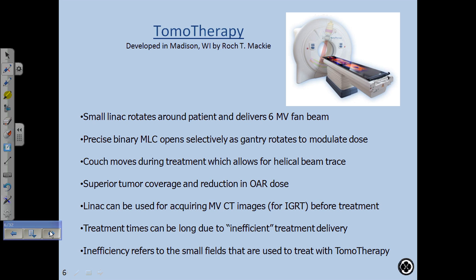So the tomotherapy machine, Don, you've seen one. You guys seen the tomotherapy machine? You two guys? Okay. Tomotherapy machine, Lutheran General Hospital, Rush has one. They're pretty much all over the place now. Good Sam has one. There's one in Joliet, at least one in Joliet. Zion has one. Here. They're in a lot of places today.